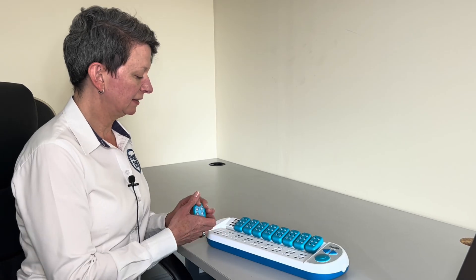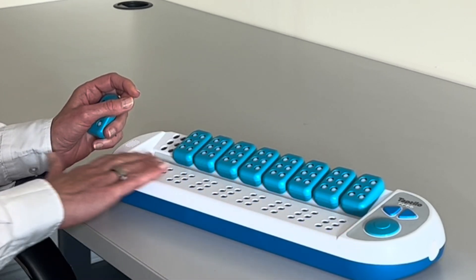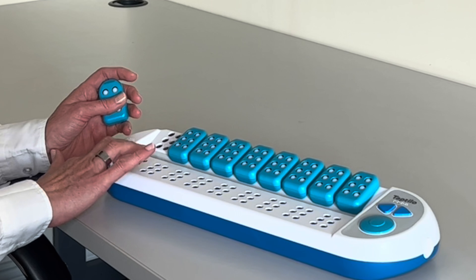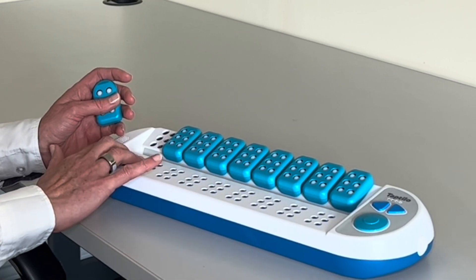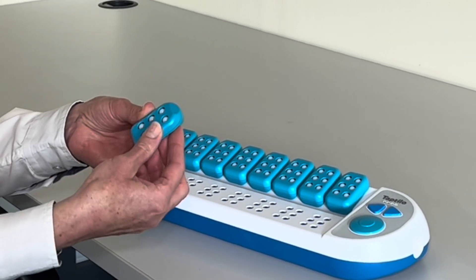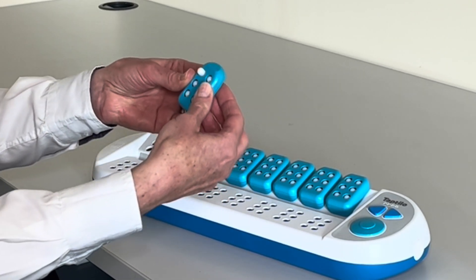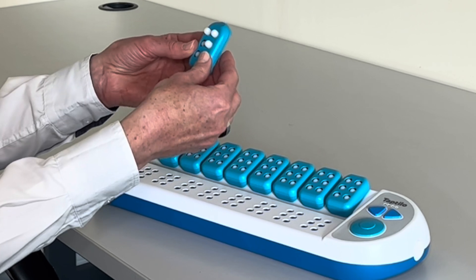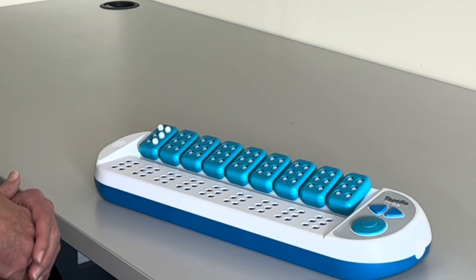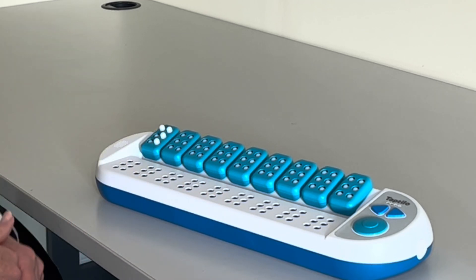It has nine cells that are for output, so you can feel a word and you can match that word with the nine tiles above it. These tiles allow you to create your braille symbols, replace them, and match them against the output here.